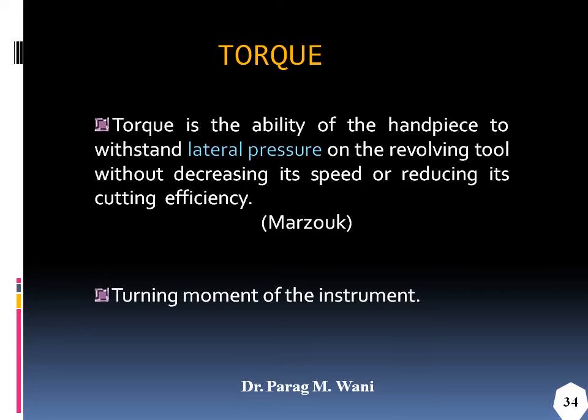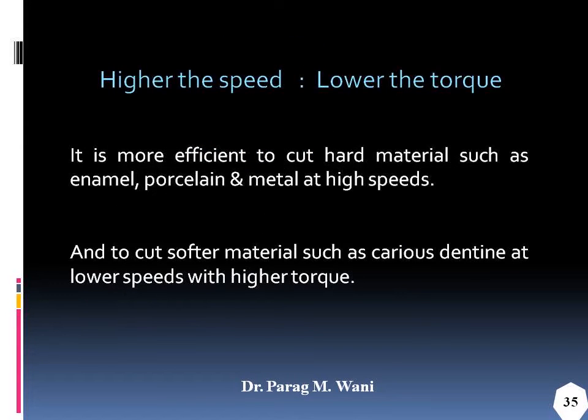Torque is the total force applied by the file while rotating on the lateral part of the canal. You should always understand that the higher the speed, the lower the torque should be. Newer NiTi files, the heat treated files, use higher speed because more cutting blades come in contact, as the cutting efficiency of NiTi goes down. So the more the speed, always remember for newer heat treated files, you should keep the torque low, between 1.5 and 2.2 Ncm.